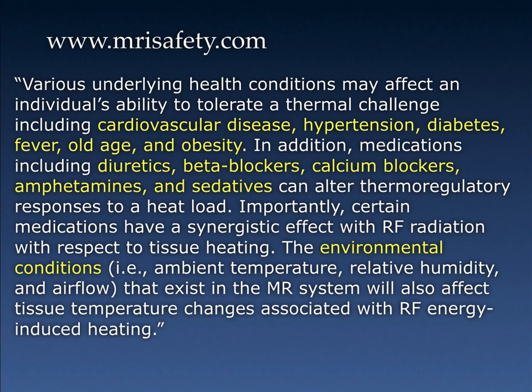So it is very important to understand that when you are scanning patients who are, shall we say, a bit on the fragile side, that have these conditions, they're likely not going to be able to dissipate heat as efficiently as someone that's healthier. So you should really take this into account if you make the conscious decision to scan greater than 2 watts per kilogram.